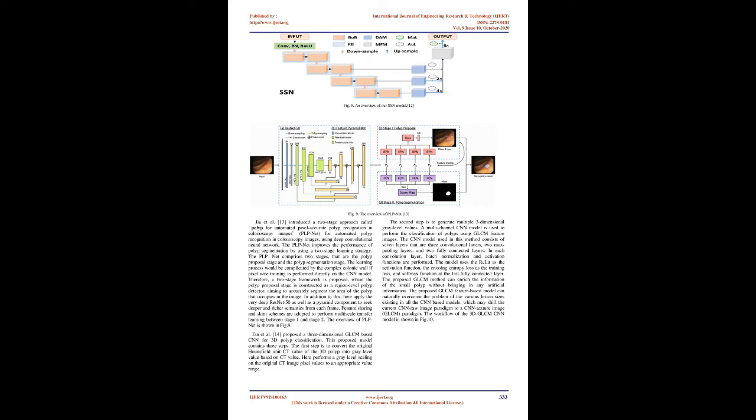Mask RCNN first detects targets in the image and produces a high-quality segmentation result for each target, i.e., it provides an instance segmentation of polyps. Compared to other networks discussed in these studies, Mask RCNN is very fast and a little more efficient for polyp segmentation. The detailed framework of Mask RCNN is shown in Fig.5.